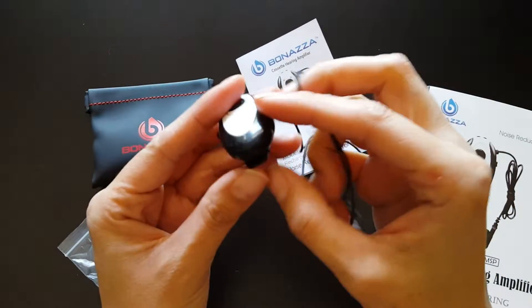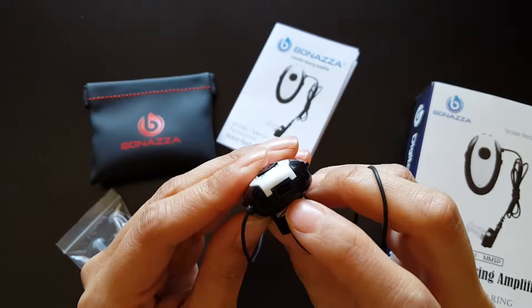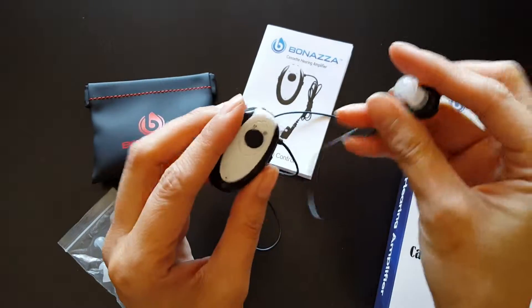So you don't need any batteries. You just plug it in right there. I plugged it in for 24 hours, but it probably takes about 8 hours to get a full charge.